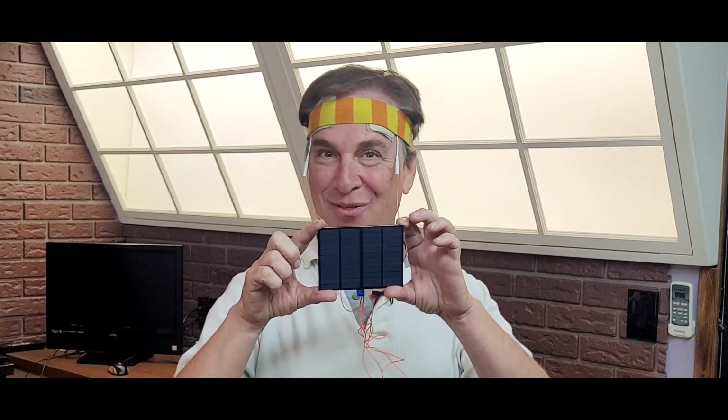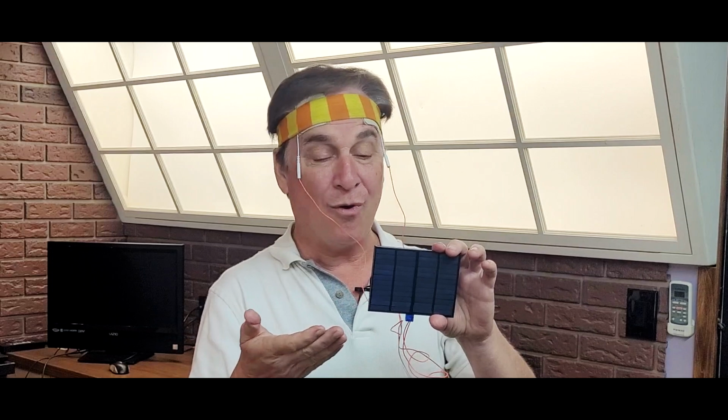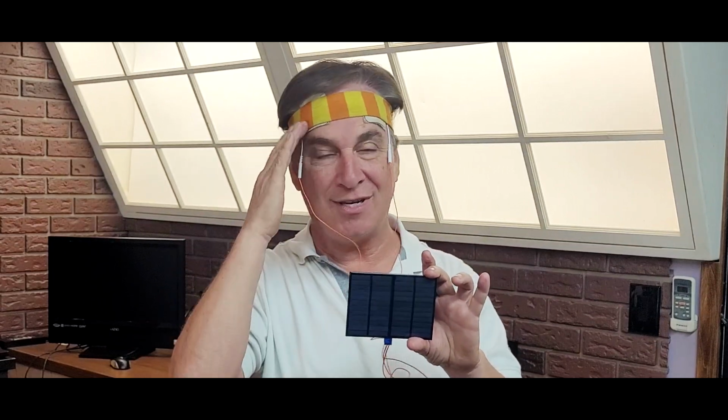And I was looking around and I thought about those little solar panels on the garden lights out in the yard. Those will produce quite easily maybe 100 or even 200 milliamps of current, which is way too much. You would never want to attach one of these panels directly to electrodes that touched your skin or attached to you in any way, because that could definitely create a burn. 100 to 200 milliamps is way too much, even 50 milliamps. We're looking for between 0.5 and 2 milliamps.